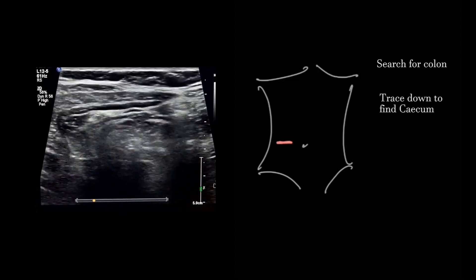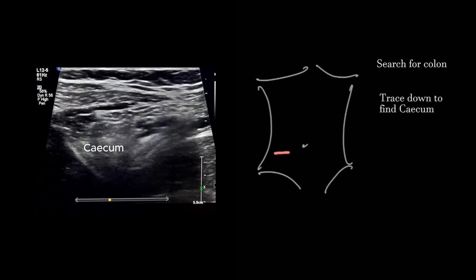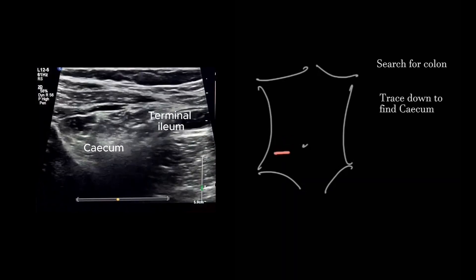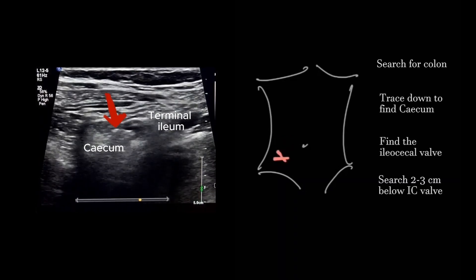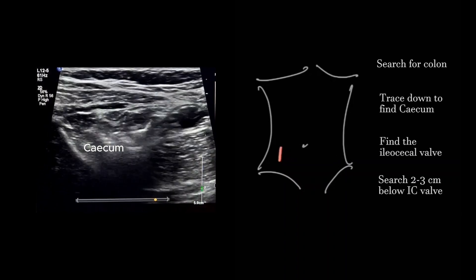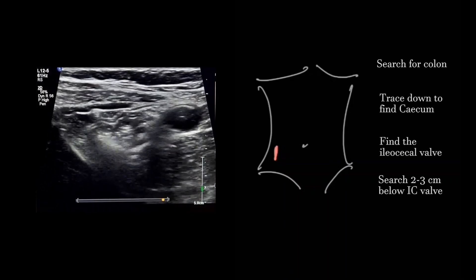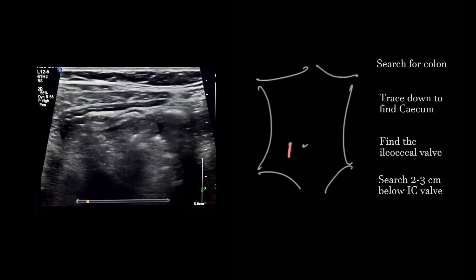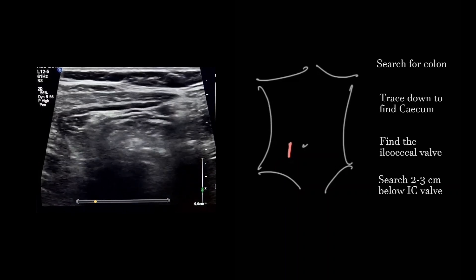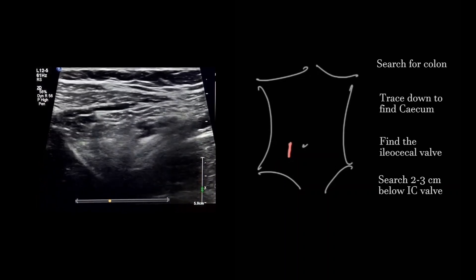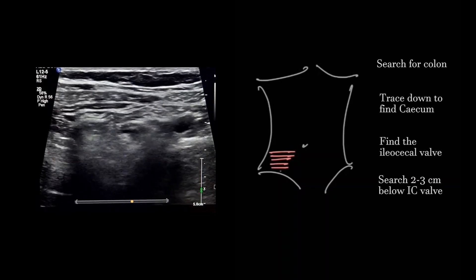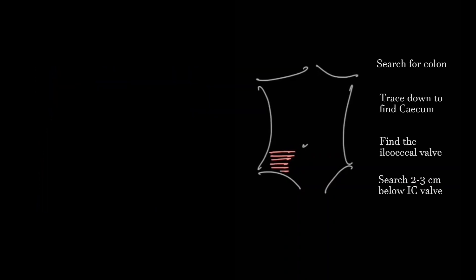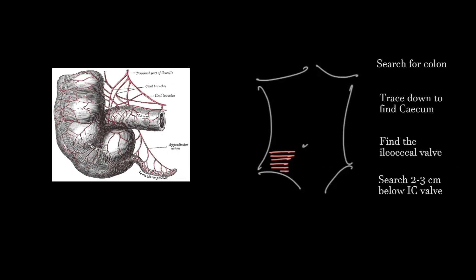Then we need to trace it down to find the cecum and the ileocecal junction. The appendix usually lies around 2 to 3 centimeters below the ileocecal junction.